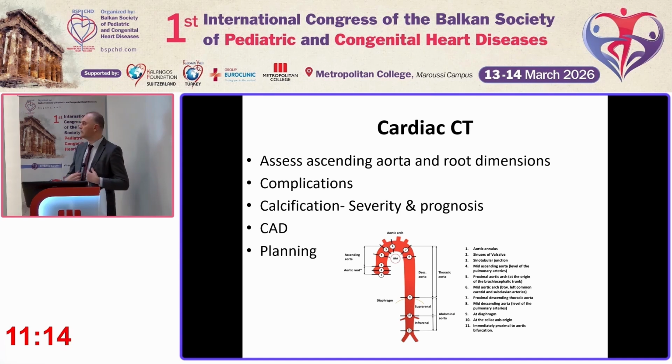Now, we should consider a cardiac CT whenever the aorta assessment is in question, and in particular in the acute scenarios, if there is a suspicion of complications, such as dissection. It has a rapid nature, and it has an excellent spatial resolution. It is the exam of choice in that clinical scenario. It can also, and this is an advantage compared to magnetic resonance, demonstrate efficiently calcification of the valve.